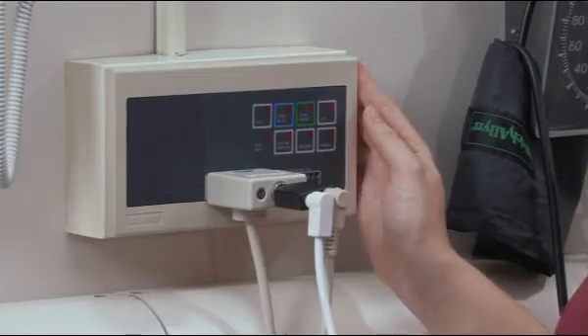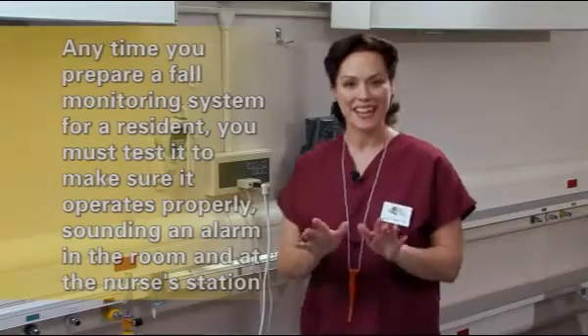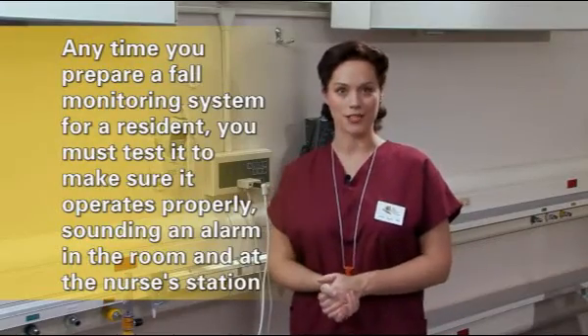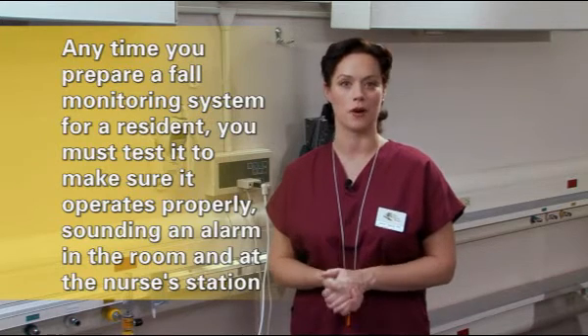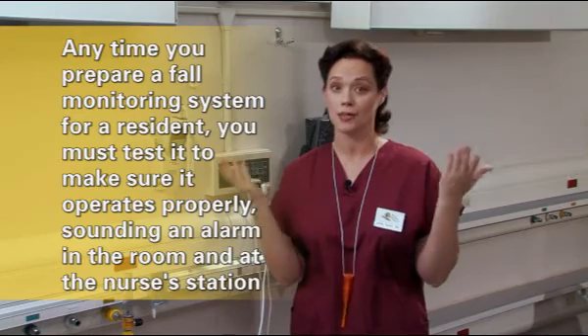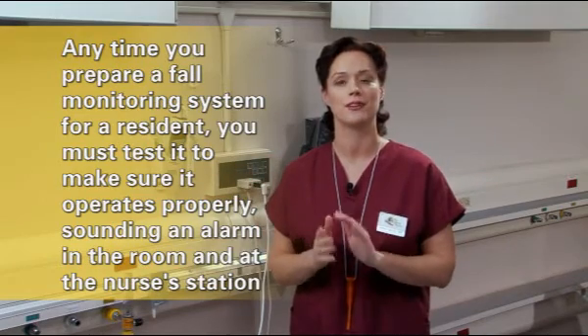This fully integrated system is ready to go. Any time you prepare a fall monitor system for a resident, you must test it to make sure it operates properly, sounding the alarm in the room and an alarm at the nurse's station.